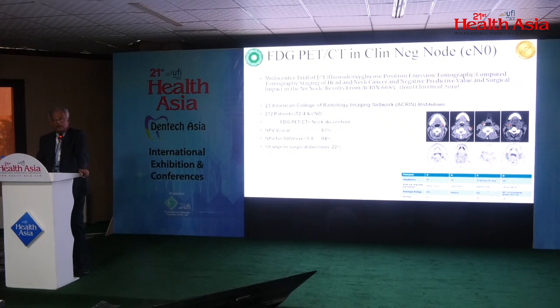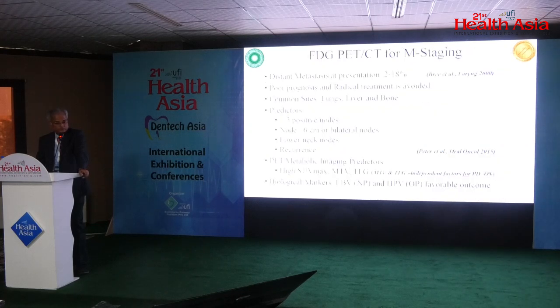An interesting finding was that the negative predictive value of the visual analysis of the PET-CT was 87%, which increased to 94% using a cutoff SUV max of more than 1.8. And in this ACRIN 6685 trial, which was published in 2019, the surgical management was changed in a sizable number of patients, that is 22%.